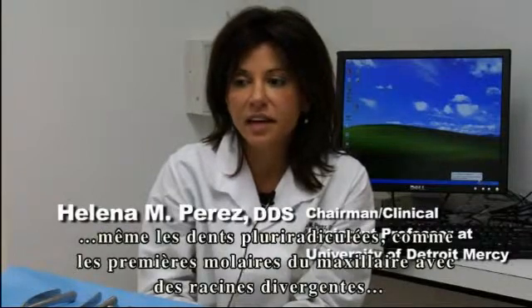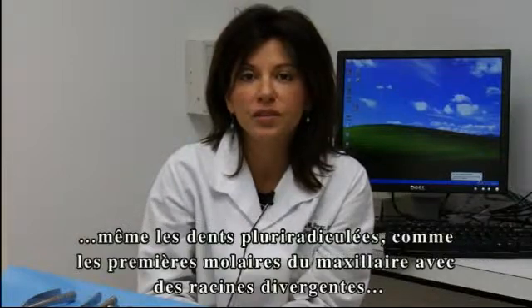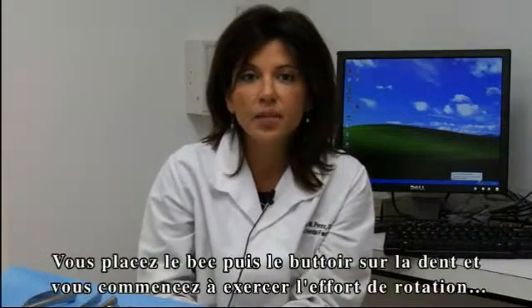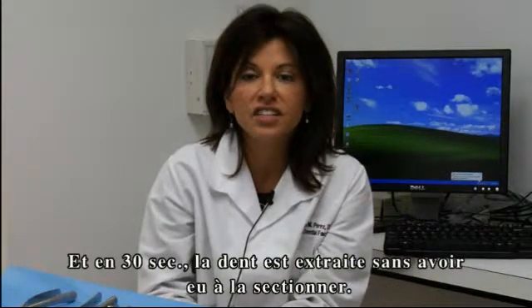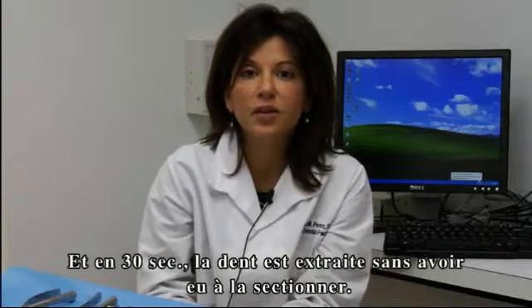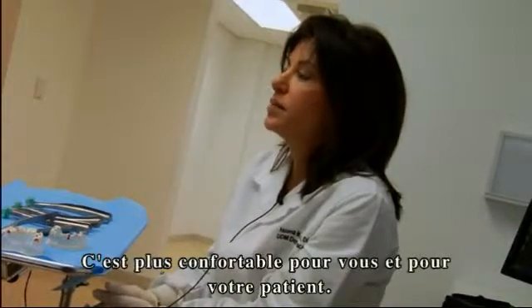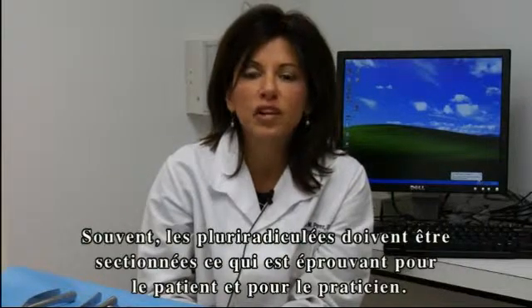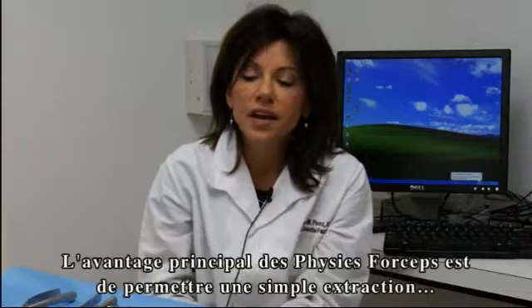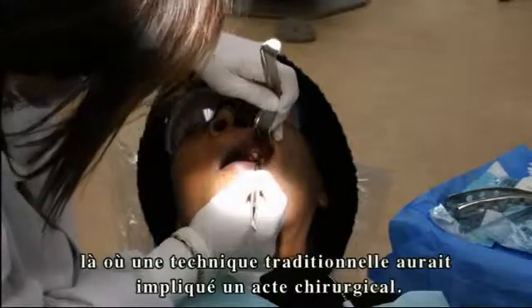Even multi-rooted teeth — for example, maxillary first molars with divergent roots — you set the beak and the bumper on the tooth, start your rotation, and after about 30 seconds the entire tooth will be elevated without having to section the tooth. This saves you time and also reduces trauma to the operator as well as to the patient. Often multi-rooted teeth have to be sectioned, which can be more stressful for patients as well as the doctor, so the major advantage is doing simple extractions where they would have been surgical otherwise.